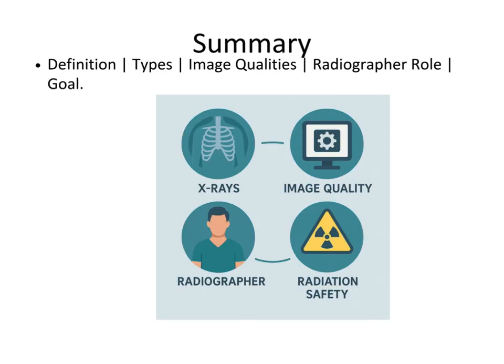Slide 14, Summary. To summarize, radiological imaging is the foundation of diagnostic radiology. Image quality depends on exposure factors, patient positioning, and radiographer skill. The ultimate goal is to achieve diagnostic accuracy while ensuring patient and operator safety.